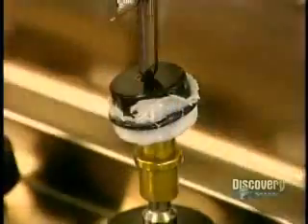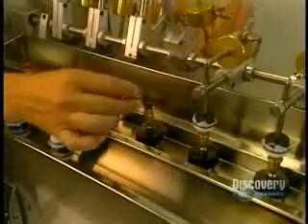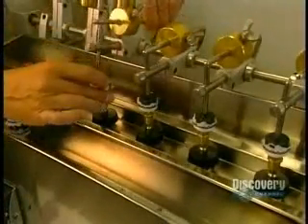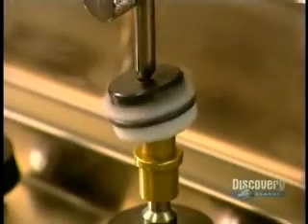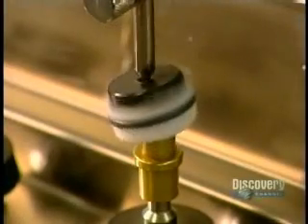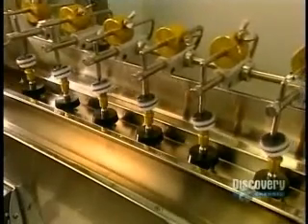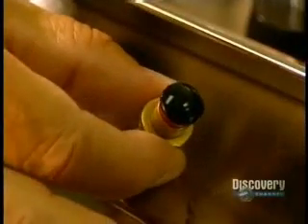They now polish the outer surface of the lens. This polishing, done at high speed, calls for an abrasive paste, some oil, and a small polyester cotton ball. This apparatus polishes several lenses at the same time, a step that takes only 60 seconds. With everything computerized, quality is incomparable. A technician then polishes the rims of the lens.